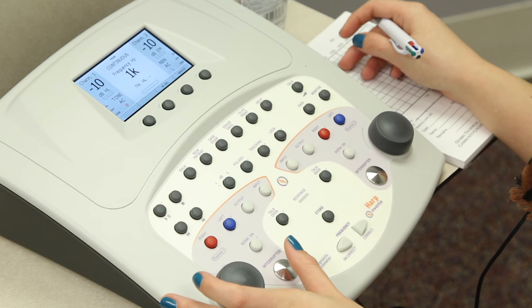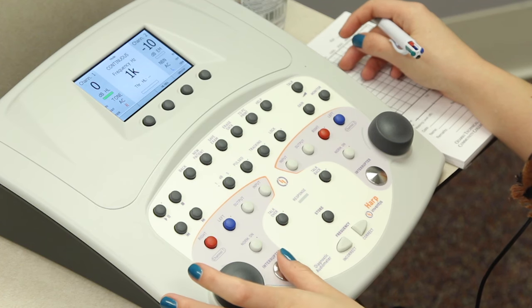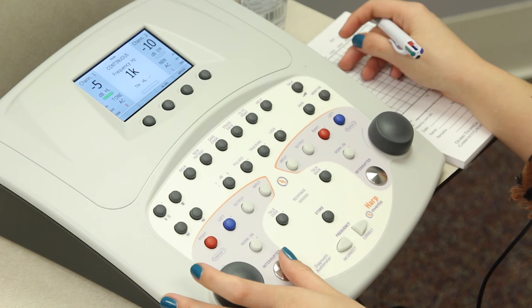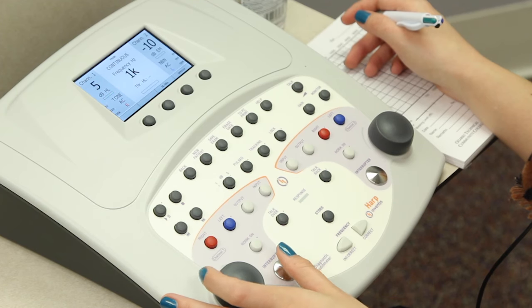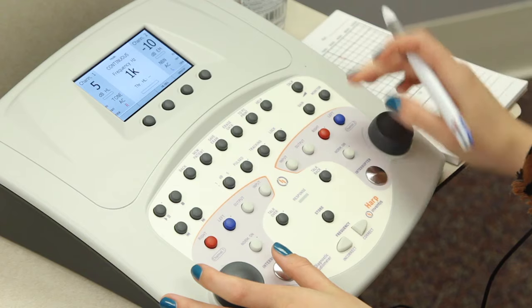He didn't respond at negative 10, so I'm going to bring it up by 5 until he does respond. And now I'm just going to verify.